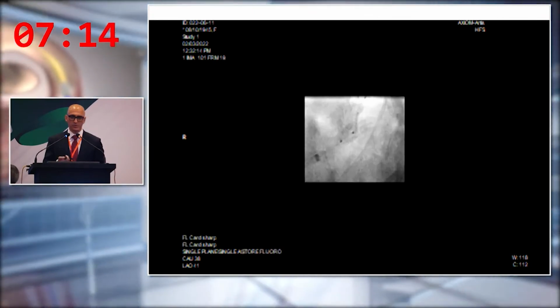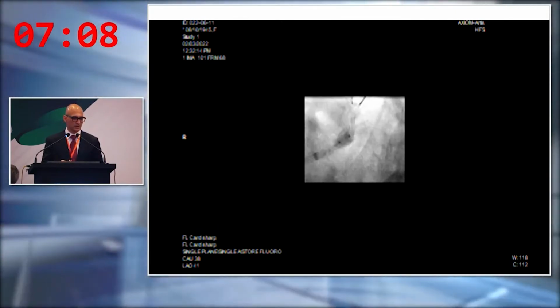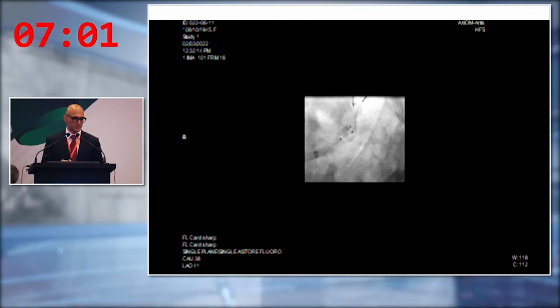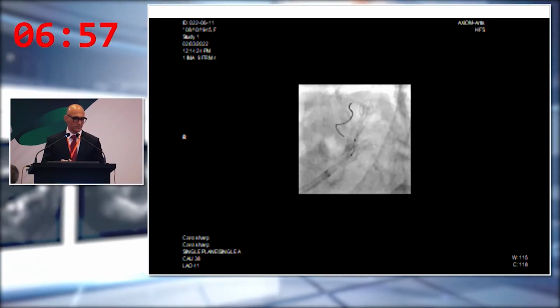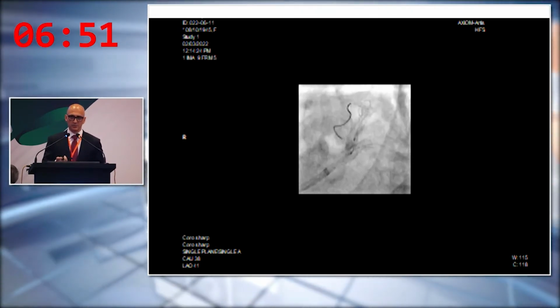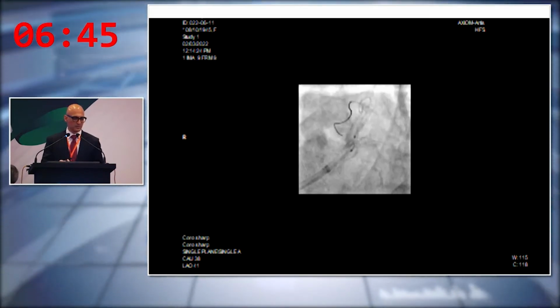We do tend to do a lot of POT also when we end, and before you recross the vessel, in this case the LAD, we did POT of the proximal segment of the left main to circumflex stent to optimize it with a 5.0 balloon. Then a DCB or DEB was done from the left main to the LAD because there was significant disease and some evidence of carinal shift towards the LAD ostium.